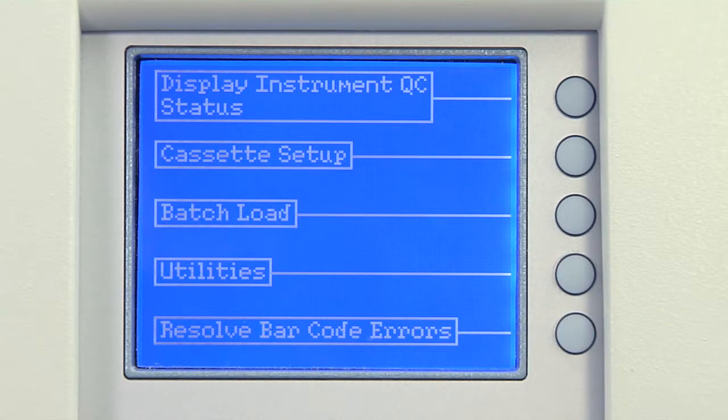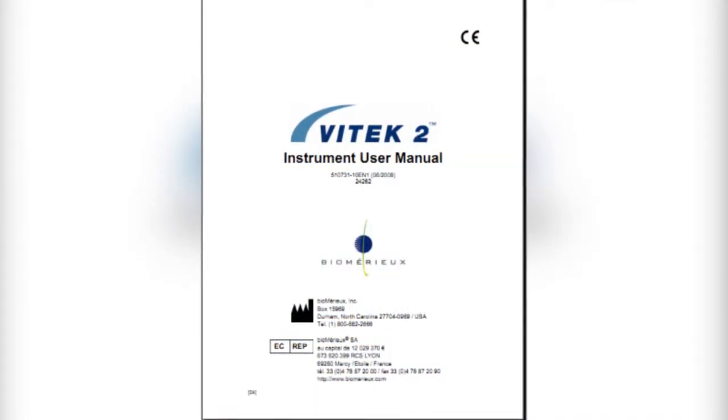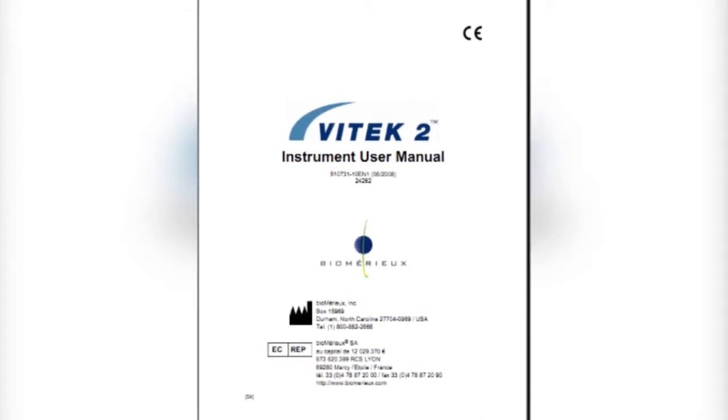Other options on this list are Cassette Setup, Batch Load, Utilities, and Resolve Barcode Errors. Information about the remaining functions can be found in the Instrument User Manual. This concludes our introduction to the VITEK 2 user interface.